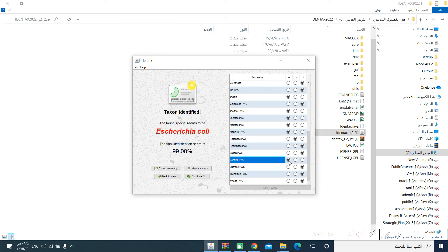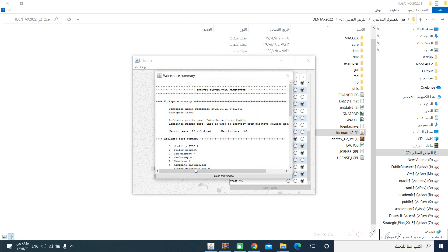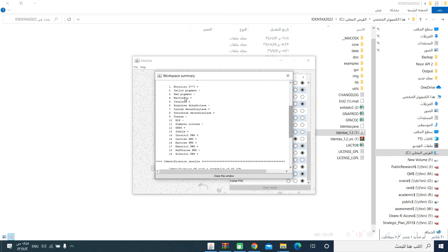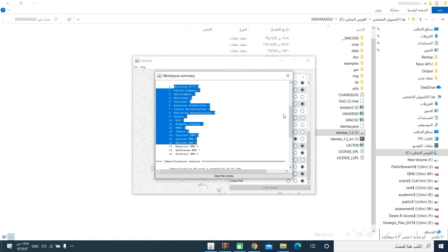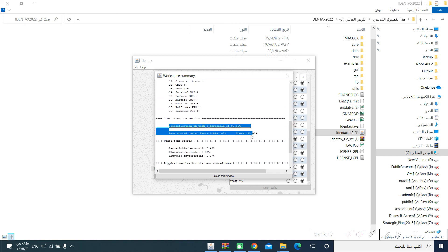Notice now that the result has stopped accepting a new test, and the organism that is being identified is now announced to you, which is Escherichia coli. And the final identification score is 99.9%. You can either export the summary or view the summary. We will try to view the summary, which is a text file. You can save it. This is the test that you have entered, and this is the result that has been obtained.